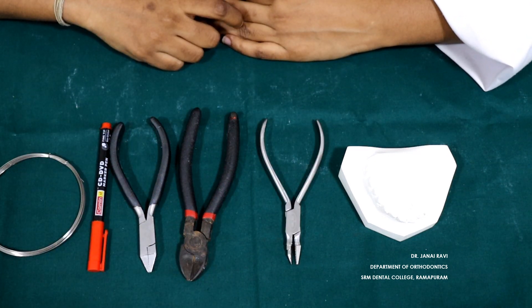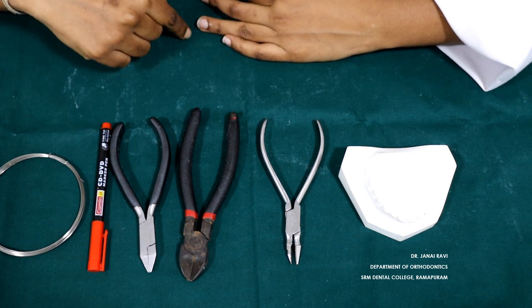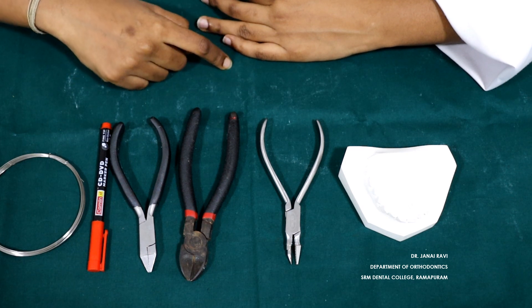We are going to see the demonstration of single cantilever springs. These are the armamentariums that will be required: 23 gauge wire, a marker, an Adams plier, heavy wire cutter, and a universal plier.